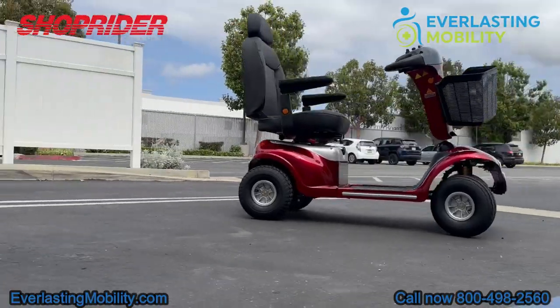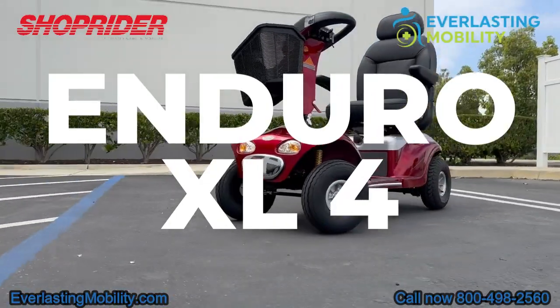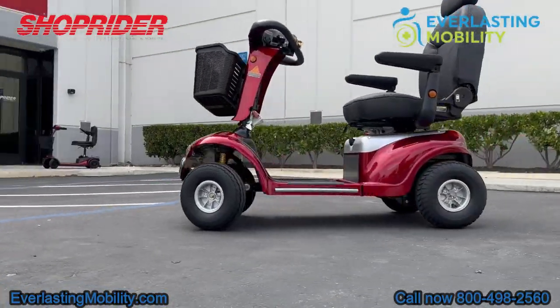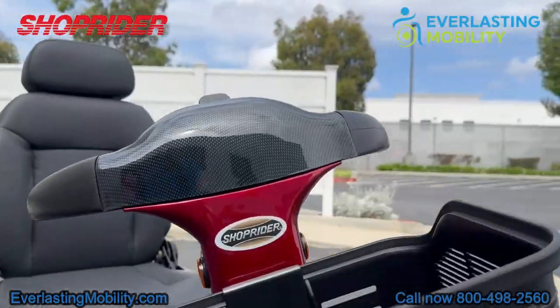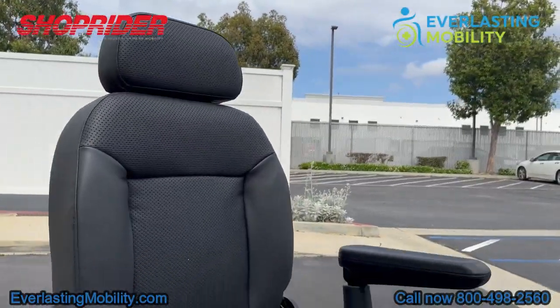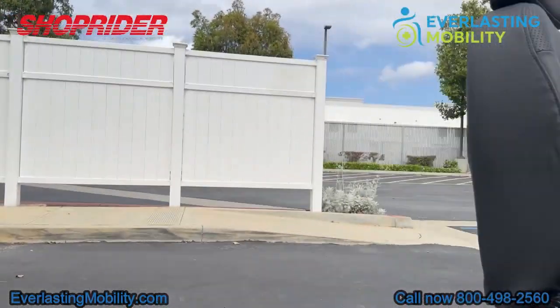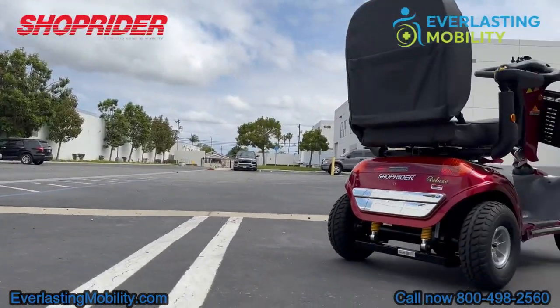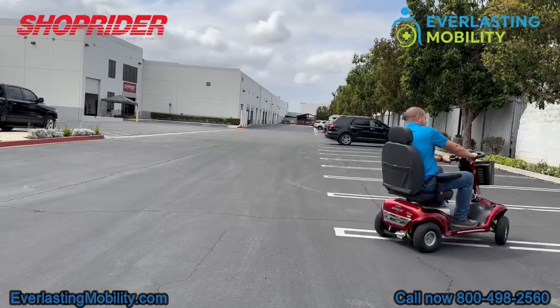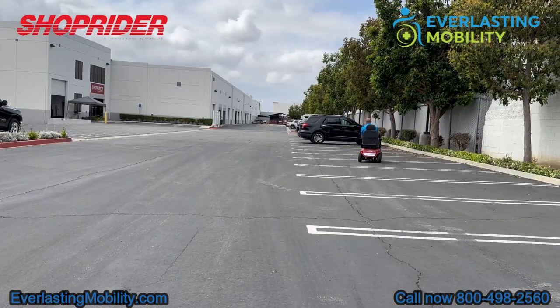In this video, we're going to go over the Enduro XL4. This is a bariatric scooter designed to elevate your mobility experience. It has a 500-pound weight capacity and a powerful 20-inch deluxe reclining captain seat. This four-wheel mobility scooter is all about combining strength and comfort. It has a long battery range of up to 25 miles per charge and front and rear suspension for a smooth ride.